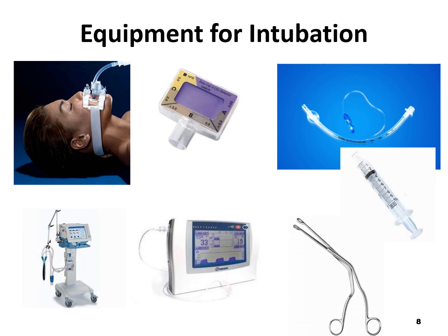Other equipment you need is the actual endotracheal tube. With that, you also need a 10 cc syringe. This 10 cc syringe is going to be attached to the blue port, which is going to blow up the balloon at the end of the endotracheal tube. The endotracheal tube comes in a variety of sizes, usually 7 to 7.5 for women, 7.5 to 8 for men. With the endotracheal tube, some facilities will check the patency of the balloon, other facilities may not. Just know what your policy is at your facility.